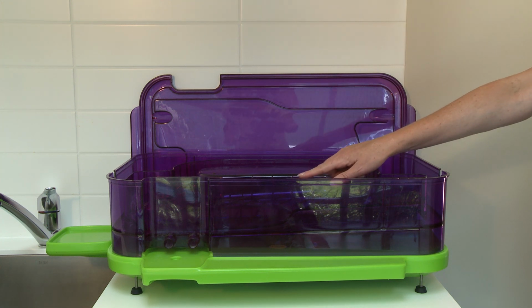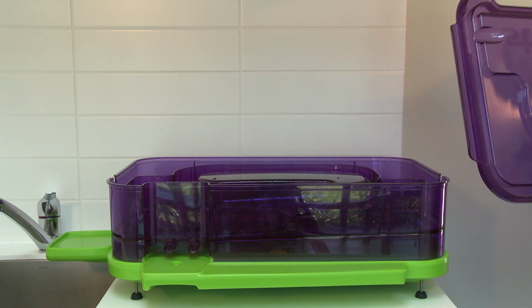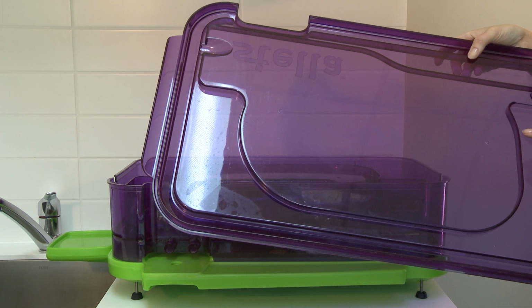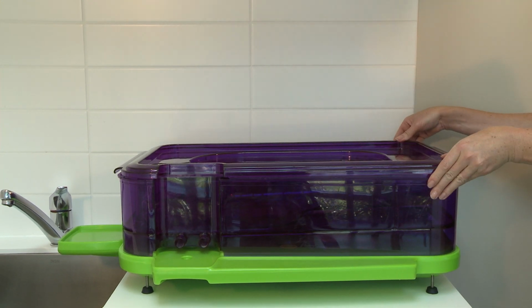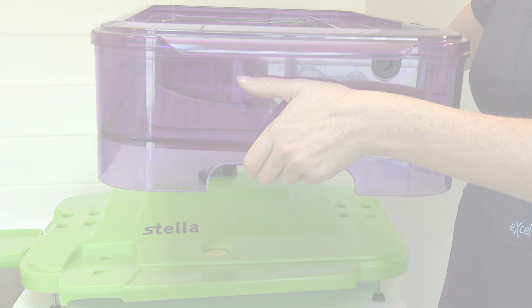The lid is shaped to fit and seal the base inner compartment. This disinfects the compartment lip and ensures that the instrument is fully immersed into the disinfection liquid during disinfection. To transport your instrument, the base and lid can be used as a transport chamber for the instrument with the easy-to-lift cutouts on the side of the base for hand grip.